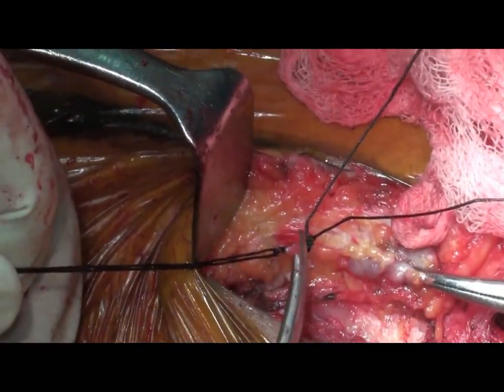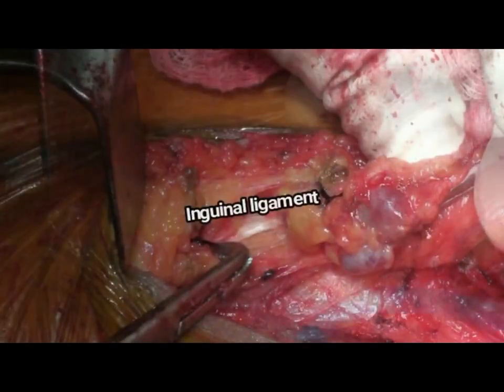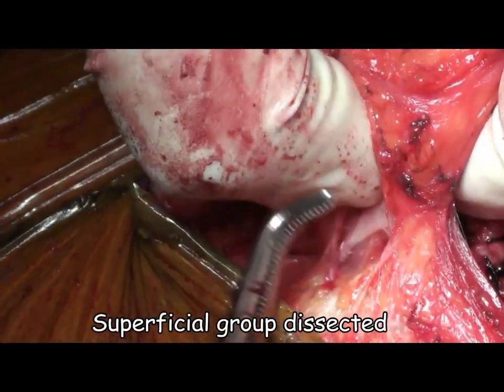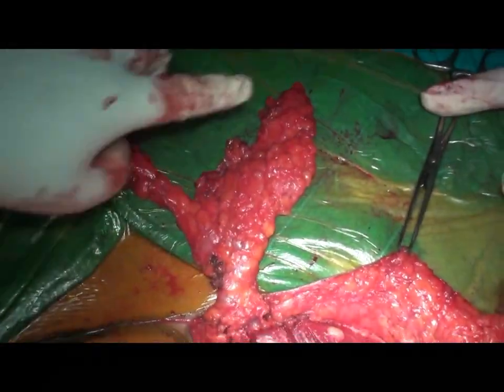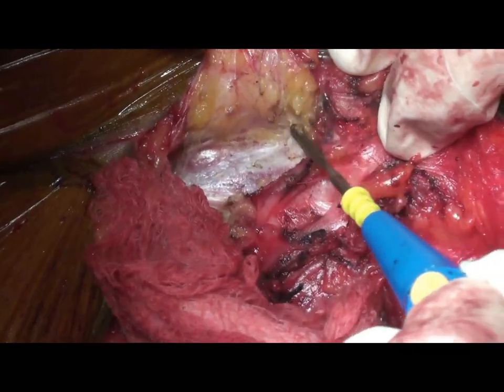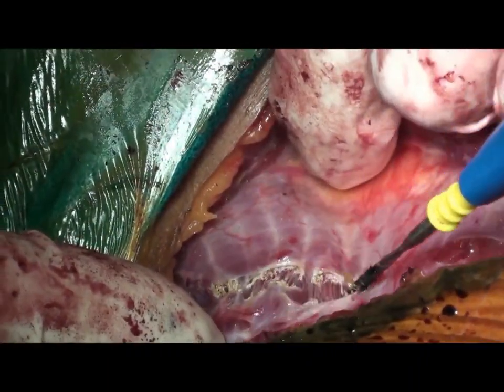It is safer to ligate these veins as they continue to ooze. The inguinal ligament comes into view. The superficial nodes are clearly visible. Ligation is done to make sure there is no lymphorrhea later on. One can also use diathermy, but ligation helps prevent lymphorrhea. The inguinal group is clearly demonstrated, completing a full dissection with all structures identified. The entire superficial group is a big chain with lots of nodes — especially prominent in carcinoma penis cases. This is a classical ilio-inguinal block dissection being demonstrated, without going into the controversy of the Cabana or other limited dissection approaches.